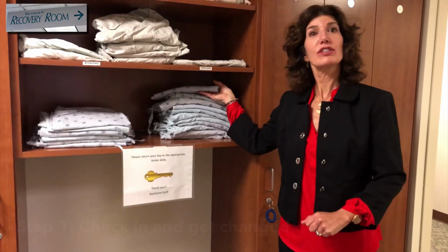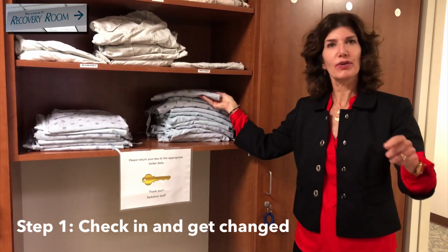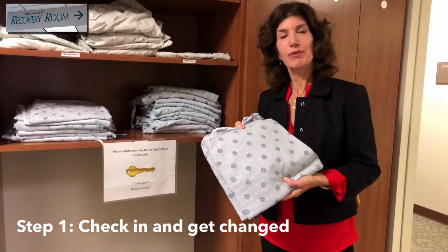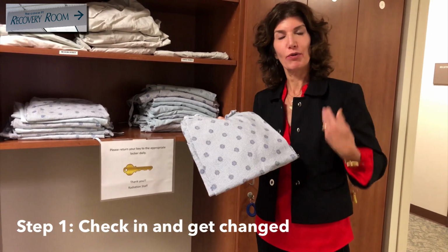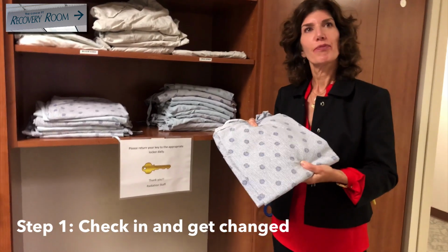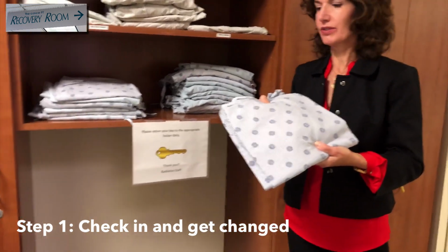Welcome. So, Dr. Ellen is actually going to take us on a tour of the radiation oncology department. Considering you are a new patient, what would you do start to finish? So you've already checked in with the receptionist, and now you've come back. You met the awesome radiation oncologist. Right. All right. So one of our lovely staff members will escort you back here, and we would give you a gown to put on. Yes, and we would instruct you on which clothing articles to remove. It depends on which site we're treating. So you can leave the rest of your clothes on. Yes. Okay, then where do we go?